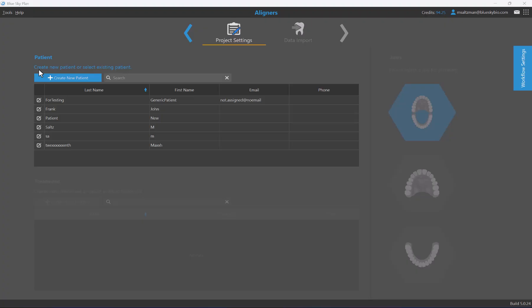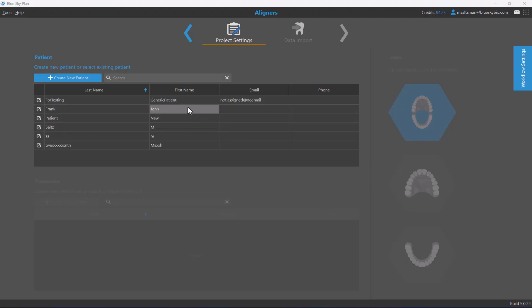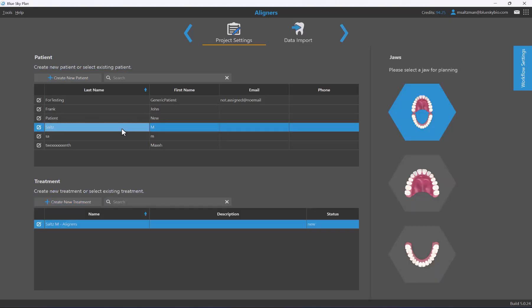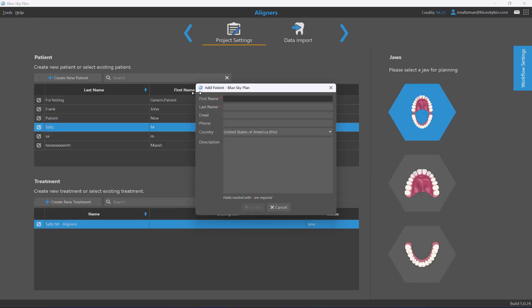The first main section on the second screen allows you to organize your cases based on the particular patient and the treatment they've come in for. You'll see a list of patients you've already created. To associate the case with an existing patient, simply left-click to select them. To add a new patient, click create new patient — the required fields indicated with a red asterisk are first name and last name.